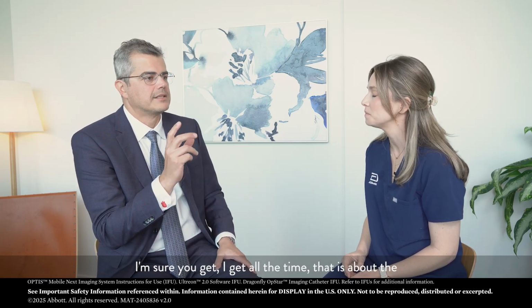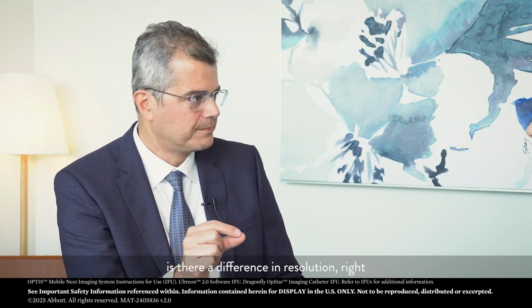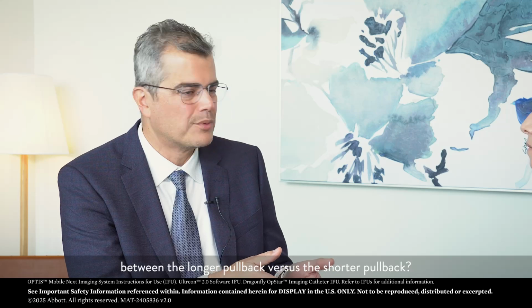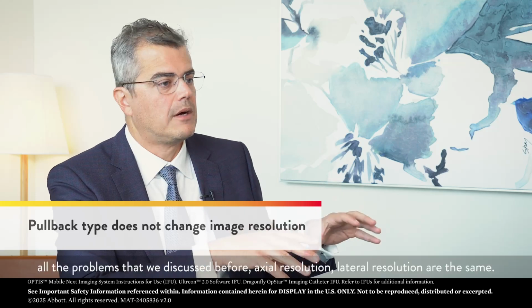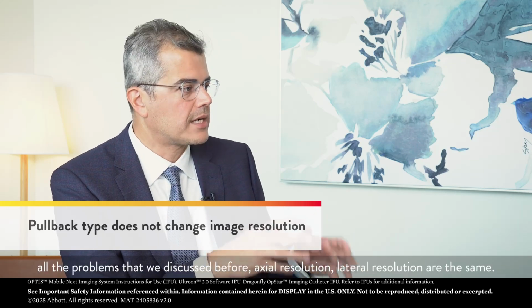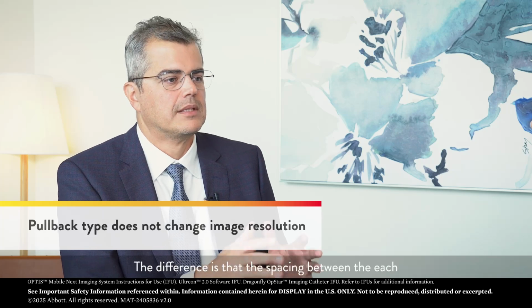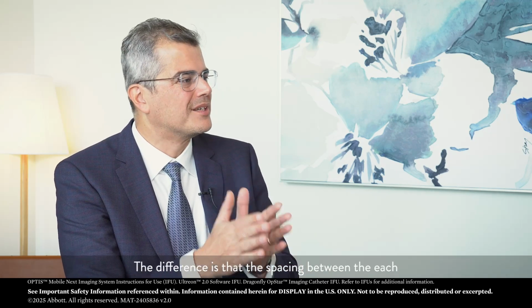All the time. That is about is there a difference in resolution between the longer pullback versus the shorter pullback? And the answer is no. So when you look at the cross section, all the parameters that we discussed before, axial resolution, lateral resolution, are the same. The difference is that the space in between each individual cross section is different, right?